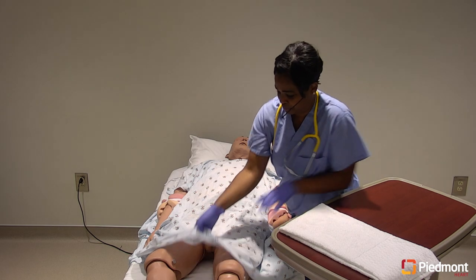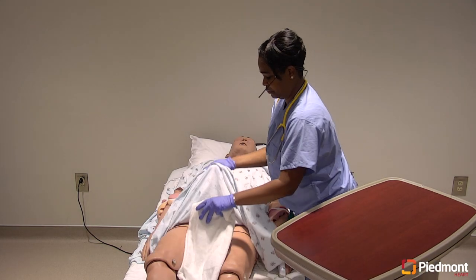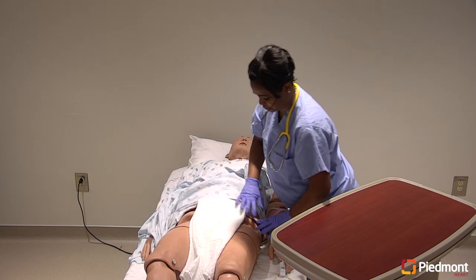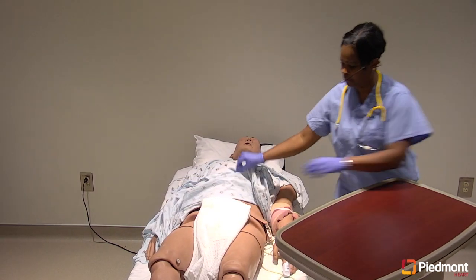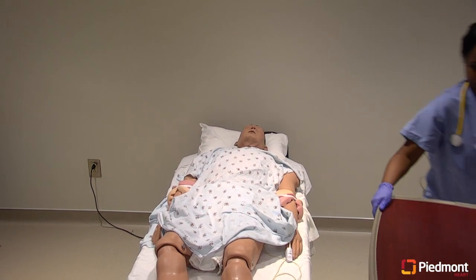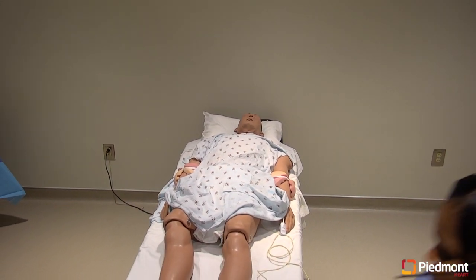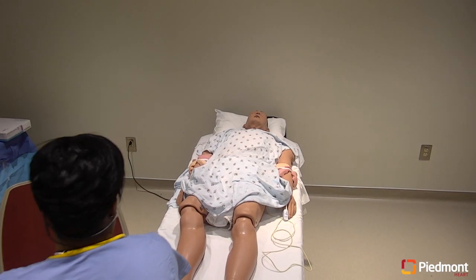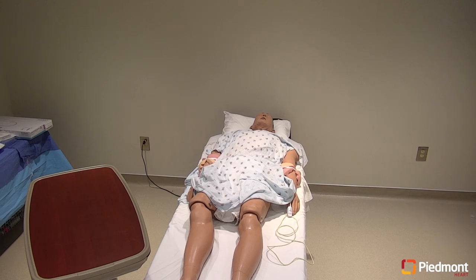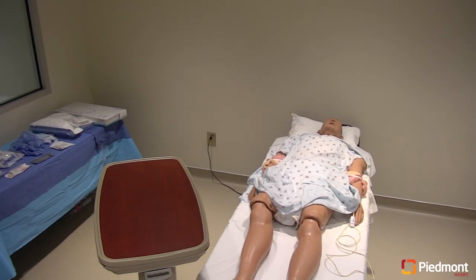Nancy is preparing the patient and the room. Patient's groins should be shaved and CHG bathed if time allows. Placing the bedside table in an appropriate position for the procedure is also ideal. Before the provider is at the bedside, you can set up the console and prepare supplies.